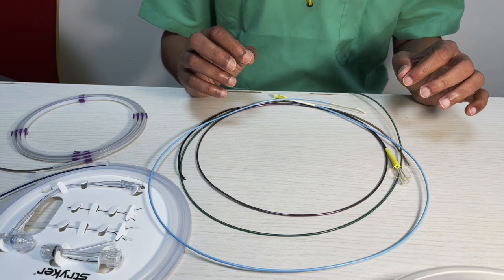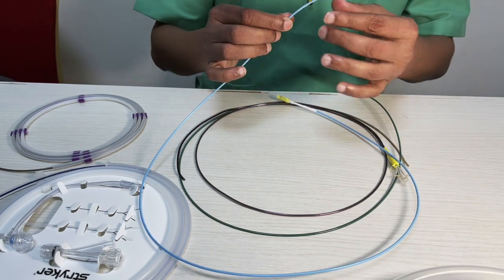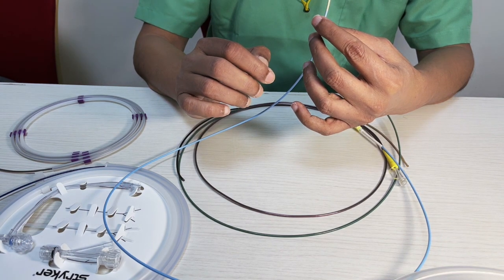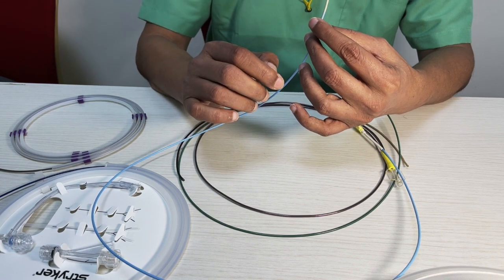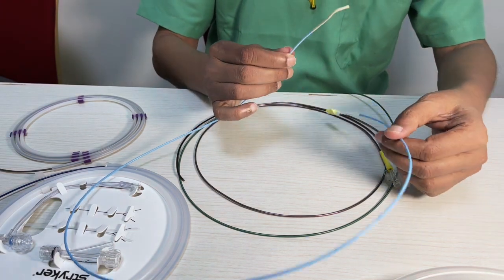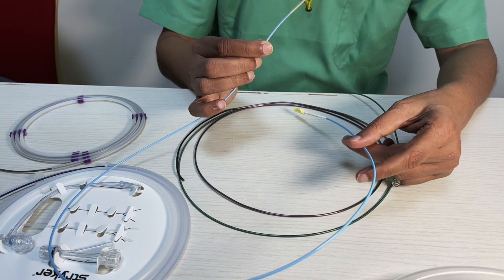So when you do neurointervention procedures, the first device that was available is called a neuro guiding catheter. Remember one thing, the neuro guiding catheters were excellent at one point of time, but today we do not use it as often as before, and I'll tell you the reason. So this is a neuro guiding catheter. This is actually from Cordis, and it's called the Envoy. It is a good guiding catheter with limitations like any guiding catheter.